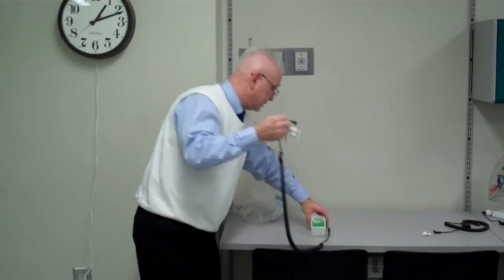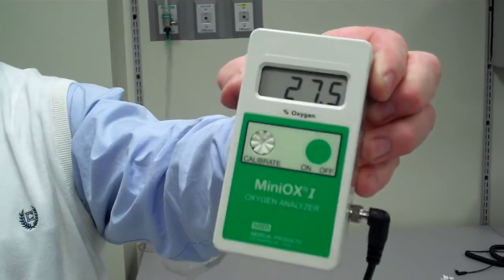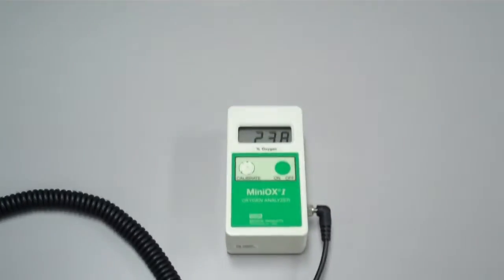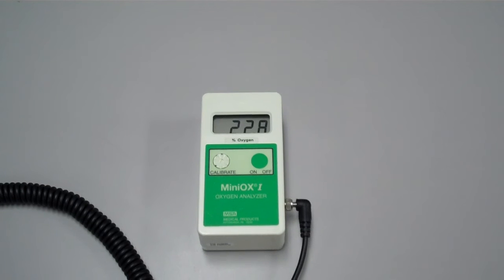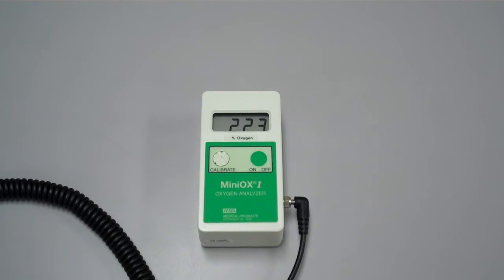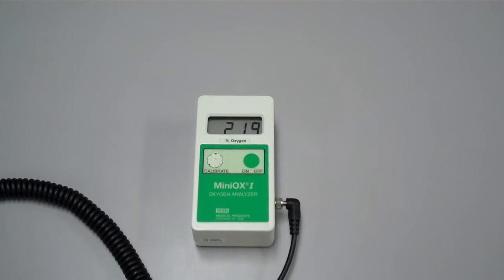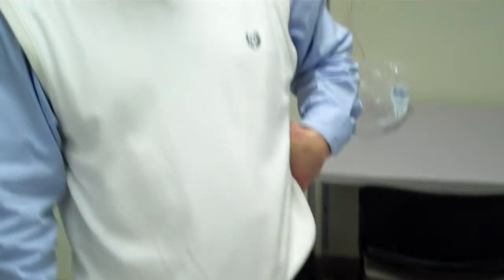Now what I'm looking for, as you can see, it's rapidly decreasing. What we're wanting it to do is we're wanting it to go back down to 21%. We're very close to 21% — we're going to 22.7 — and it's going to keep on going down until we get right to 21% oxygen.